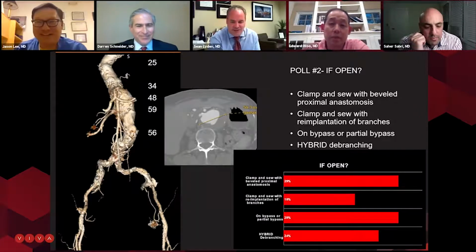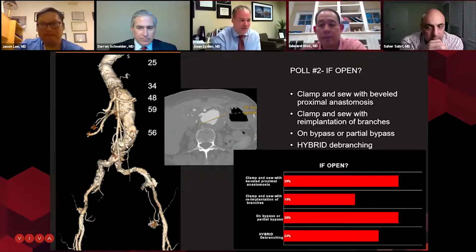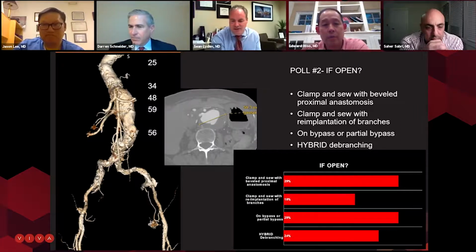The other thing, Sean, I agree with you 100%. This is one where I think you need to put on partial bypass with distal aortic perfusion. When you get that beveled anastomosis, it's gigantic to go from that right renal to above the celiac, and the chances of future degeneration are much higher as a result. And then you're going on and off because you never can get a hemostatic anastomosis because you're going to have some fluid just because it's so long. So, I would definitely do this.